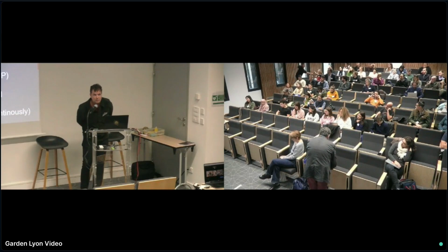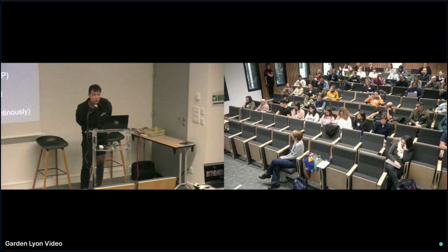How do you cluster? What I see mostly is using anatomical labels, which means that you rely on an automatic parcellization, for instance, by FreeSurfer or a MarsAtlas. And can you really completely trust this automatic labelization? I would say that maybe for most of the sites, but sometimes not. So I really like to have that immediate access to the individual anatomy just to check.